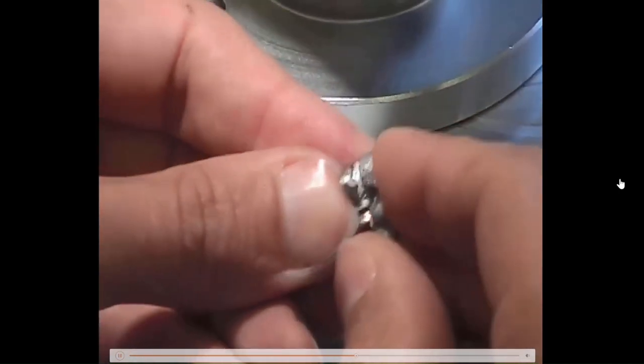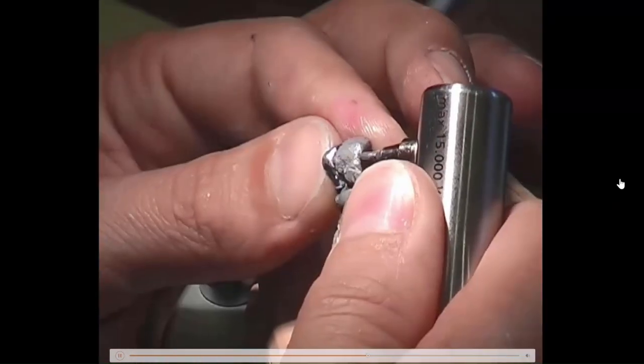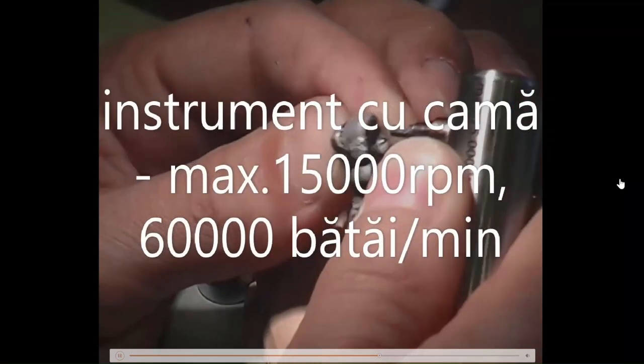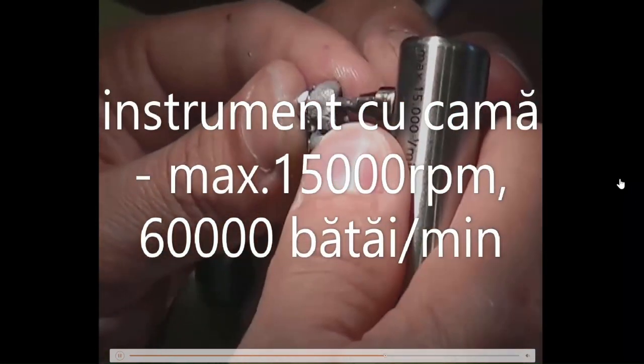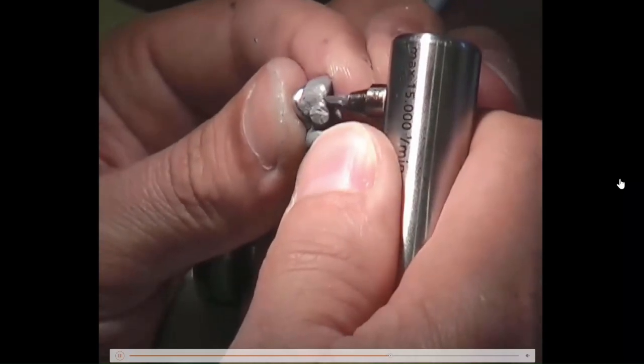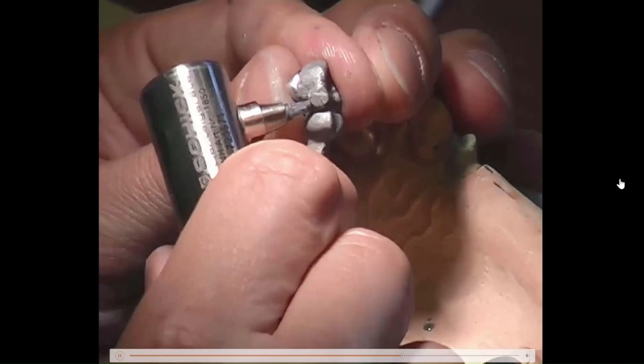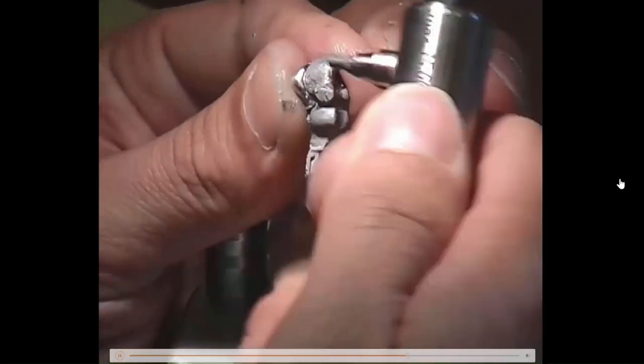You see, that's till where it goes, and then slowly you put it in, you put it out. Go in, press on the tooth, press on the other side, go out, go in, go out. And that's how we were creating the perfect fit in between the two.